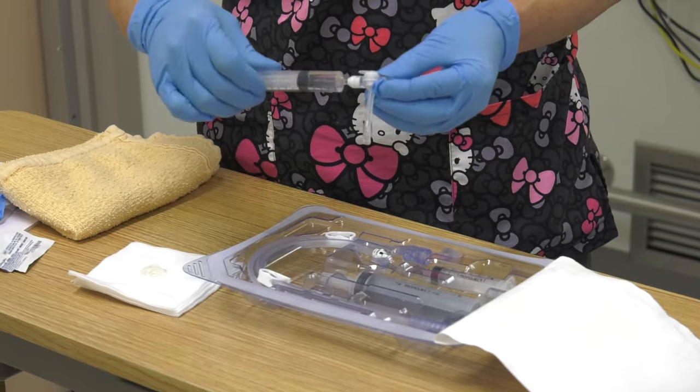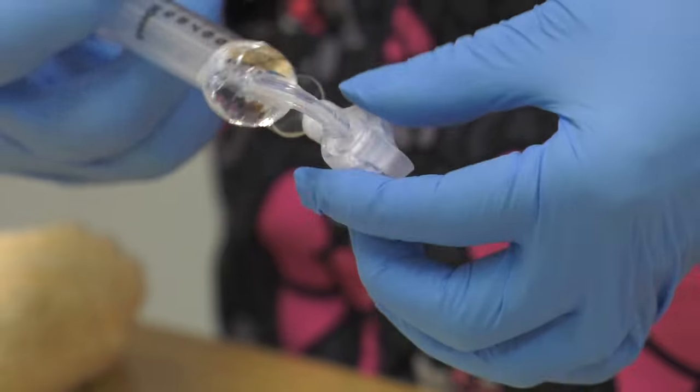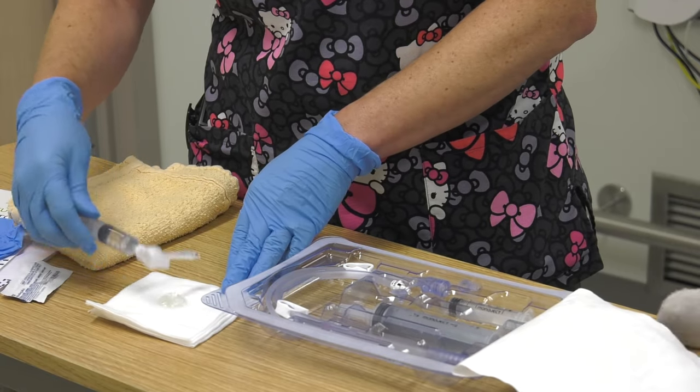The balloon should be symmetrical. Check for leaks, then remove the water from the balloon. You can leave the syringe attached.